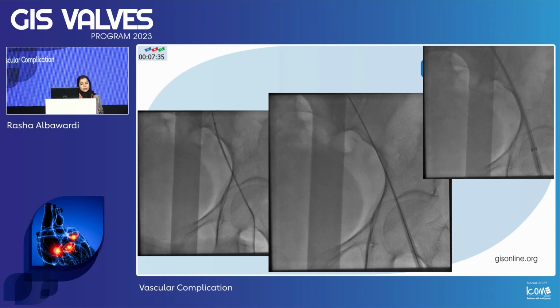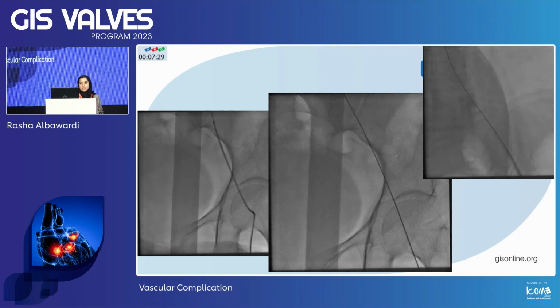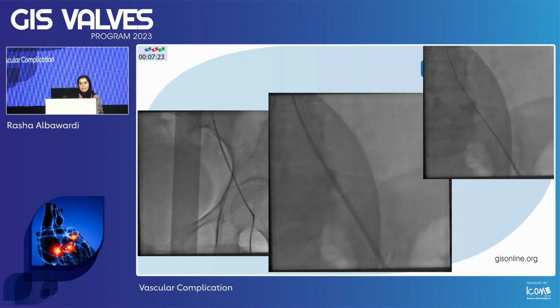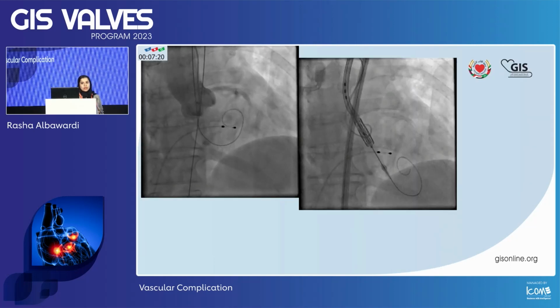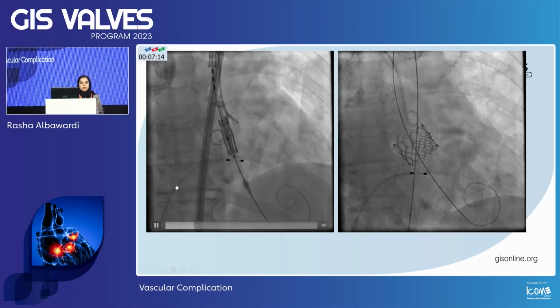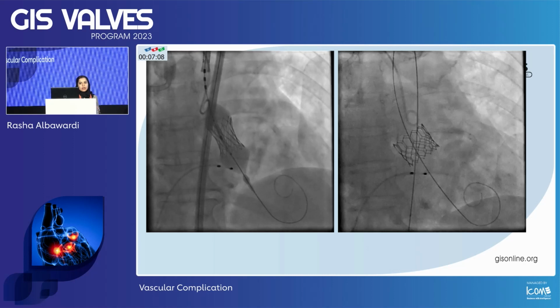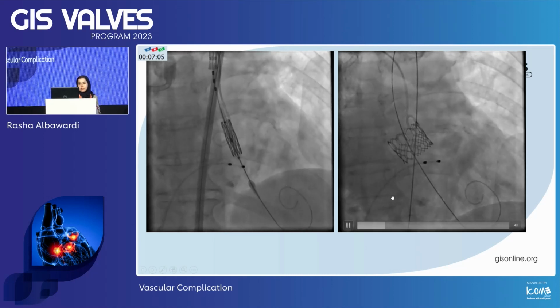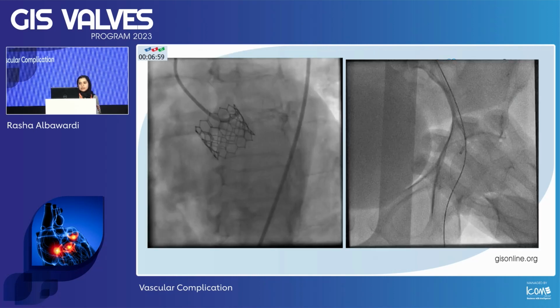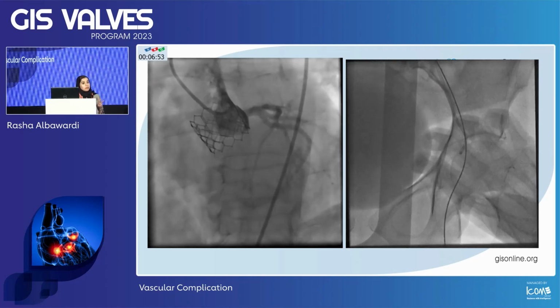So had to use a stiff wire to get the Perclose up. But as you can see with both the dilator and the sheath and the subsequent cine, that is going smoothly. Once you're inside the artery, you're fine. So deployment was fine. We knew that the left coronary height was a bit borderline, but overall did well. So deployment and the valve itself afterwards, and then a non-selective image in the next slide of the left main, which was patent. So 2 Percloses, both of them failed.